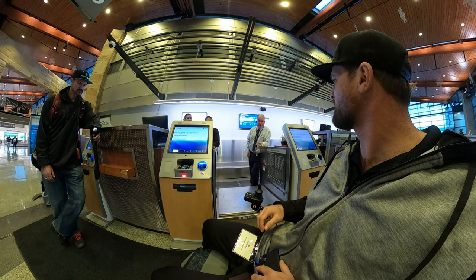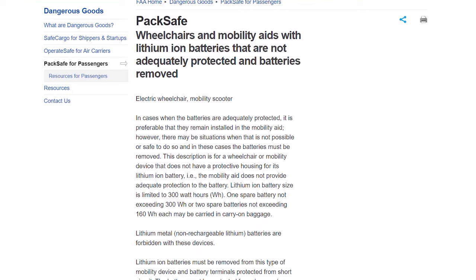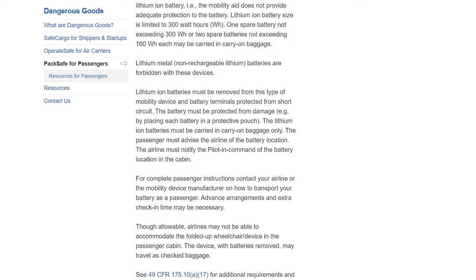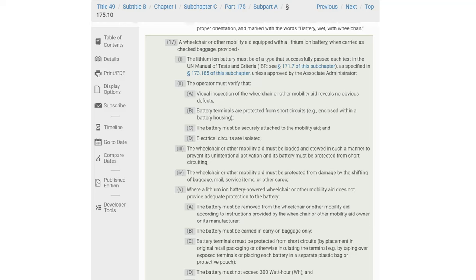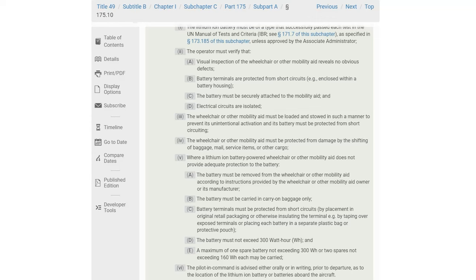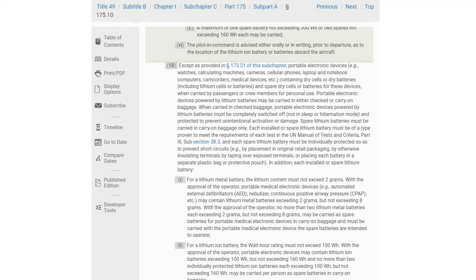It's 150. Oh, okay. So this is the FAA, Federal Aviation Administration's website's policies and procedures section on mobility scooter batteries. And this is specifically about lithium batteries. If you click on the documents, you can see all of the policies and procedures that must be adhered to by the airlines. So this is what you can expect to deal with when you are traveling with lithium batteries for your mobility scooter. Sealed lead acid batteries are not so stringent, but this is what you're going to deal with if you have lithium batteries like I do in this case.